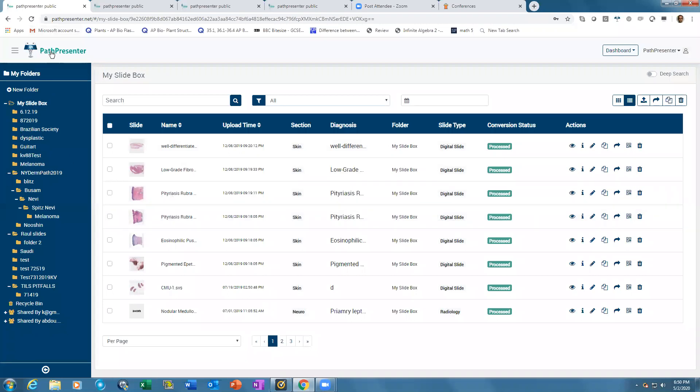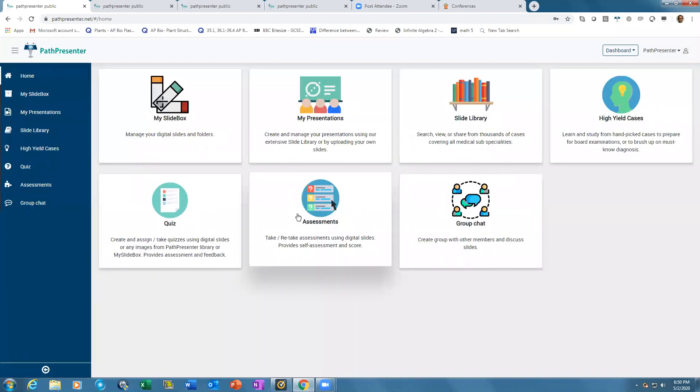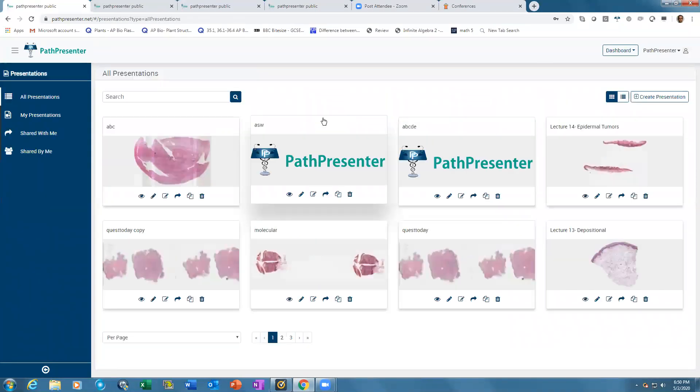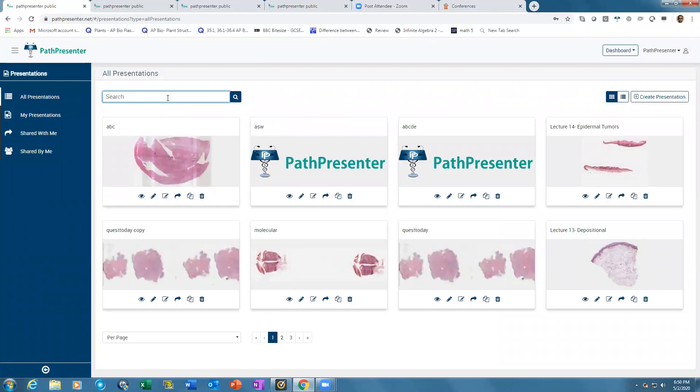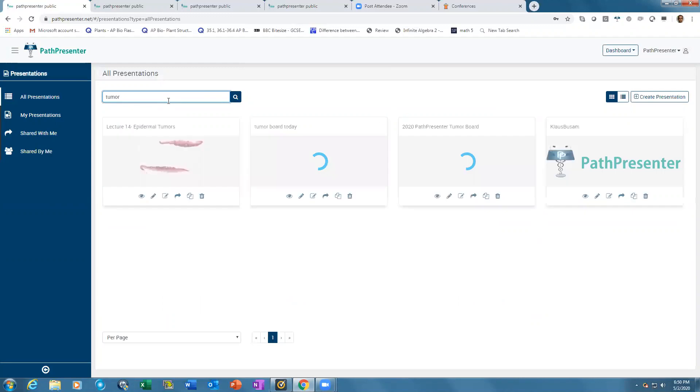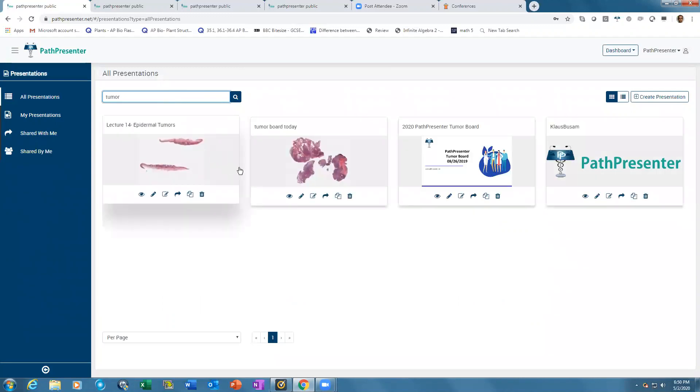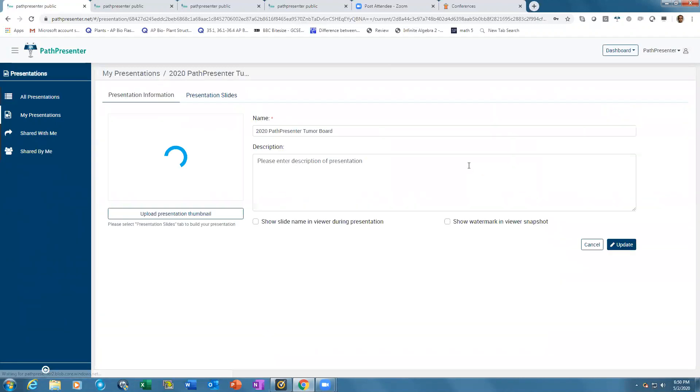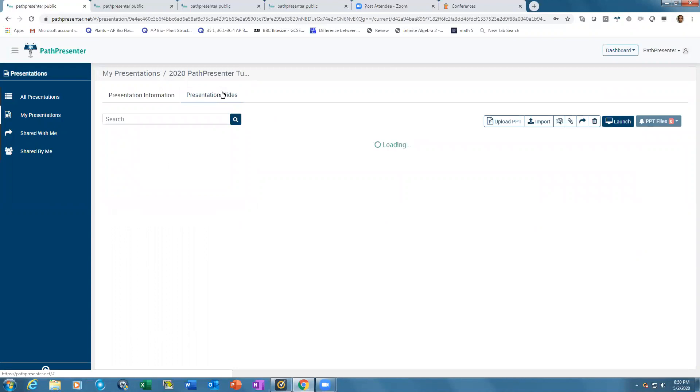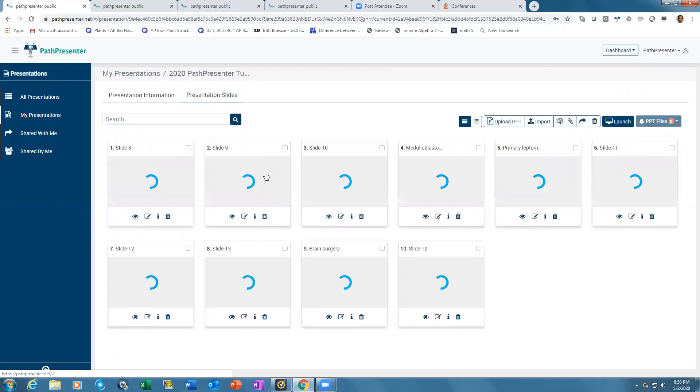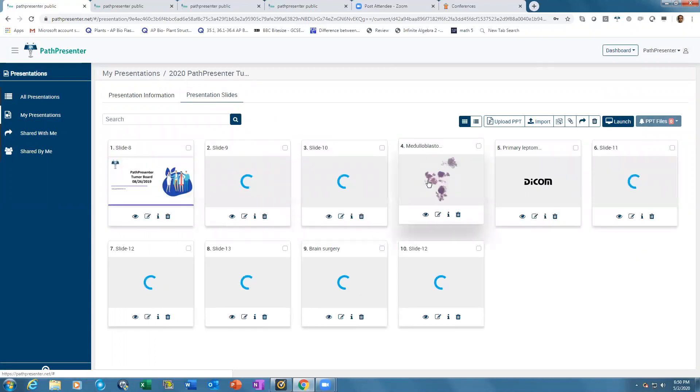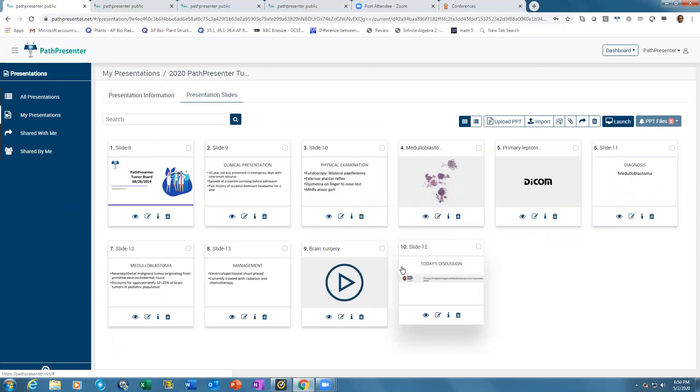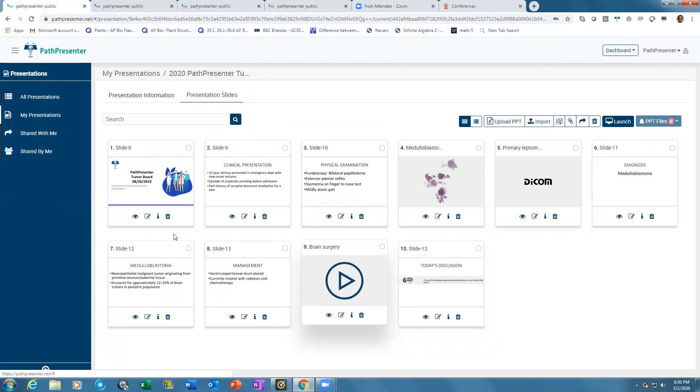The presentation tool allows you to seamlessly integrate whole slide images, PowerPoint slides, radiology DICOM images, videos, and other file formats into one spectacular presentation. Here's an example with PowerPoint slides, a whole slide image, a radiology image, and even a video all in one presentation.